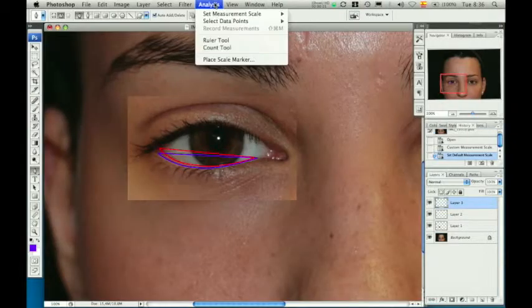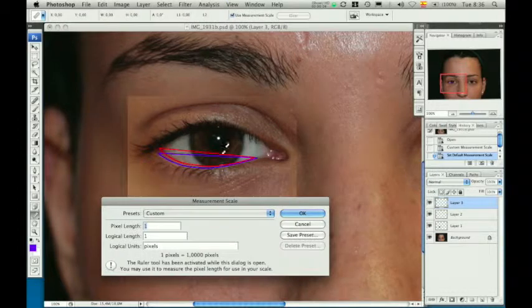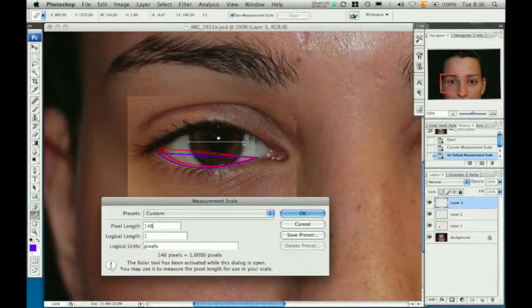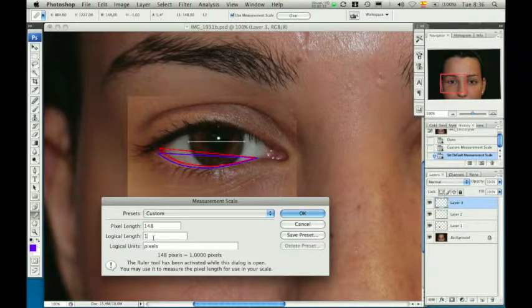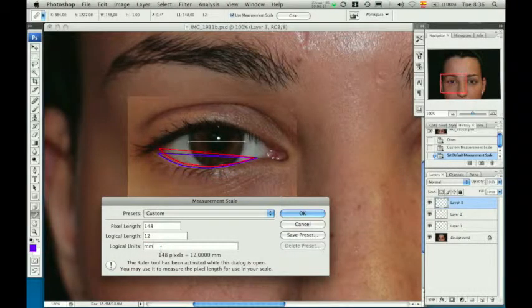In order to obtain measurements from these outlines, it is necessary to set a custom measurement scale. The corneal white-to-white length is set to 12 and the scale is set to millimeters. Now, different measurements may be obtained for each outline and compared between each other.